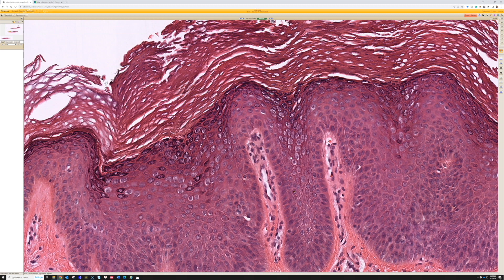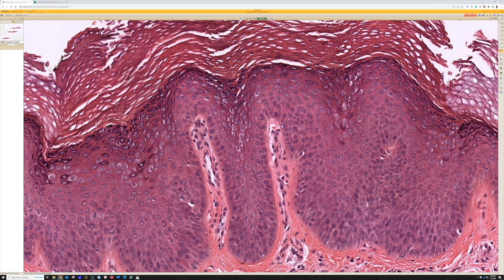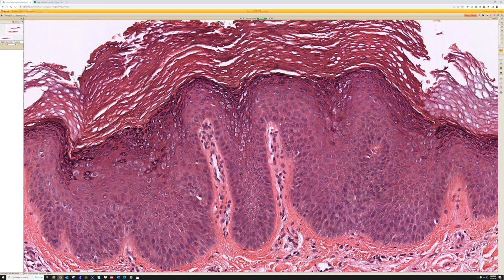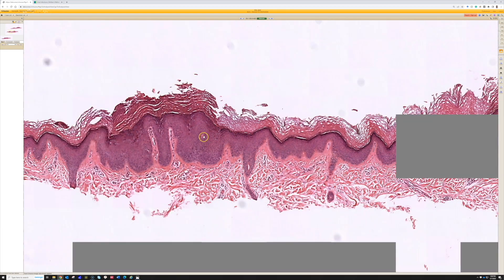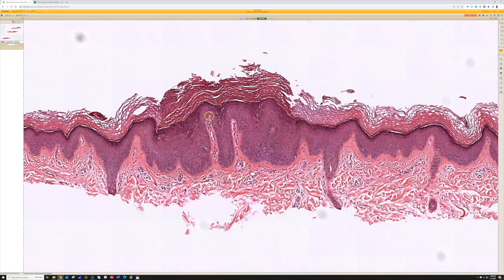The viral organisms contaminate the damaged area and start growing in it, making a linear pattern. That pattern is called koebnerization — the Koebner phenomenon is when a process tracks along a site of previous trauma, and it's classically seen in a variety of entities, one of which is verruca plana. If you get a big enough shave biopsy, you can sometimes see two, three, or even four little tiny foci of verruca plana in the same biopsy.